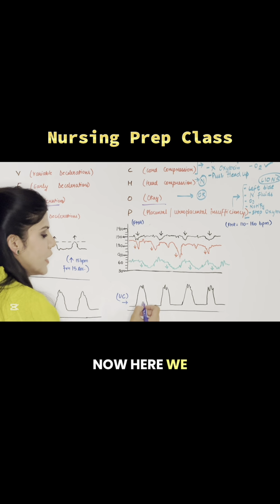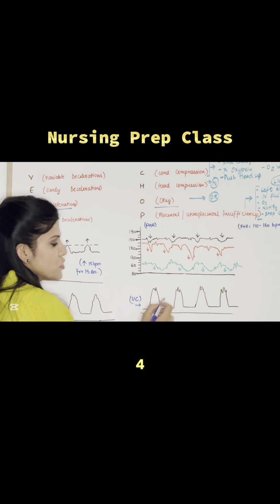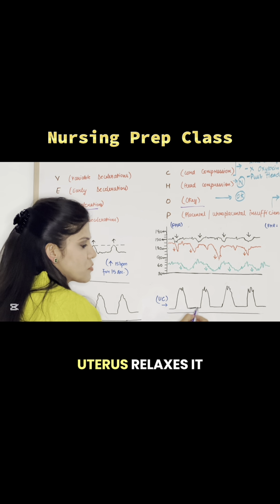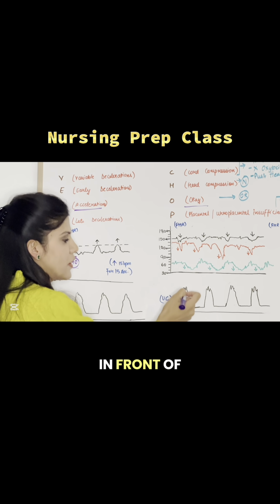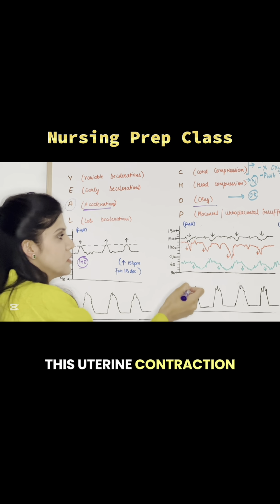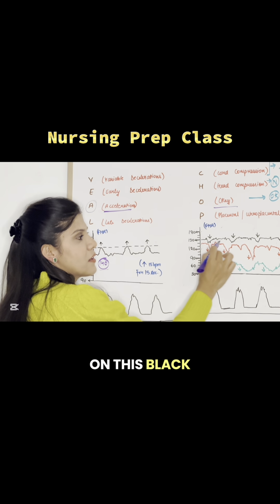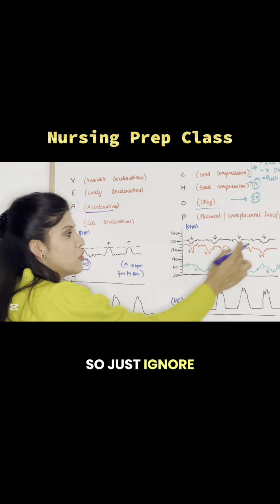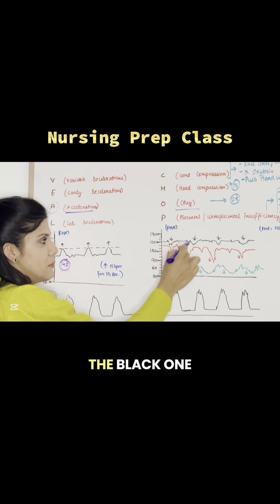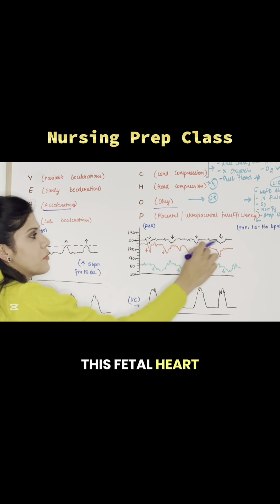Now, here we have these four uterine contractions, 1, 2, 3, and 4. So the uterine contraction peaks, the uterus relaxes, it peaks, it relaxes, it peaks, it relaxes. So in front of these uterine contractions, if we take a look at this point right here, the fetal heart rate right here on this black graph, we just need to pay attention to the black graph. So ignore this red and green, just focus on the black one. And in front of this uterine contraction, we have this fetal heart rate graph.